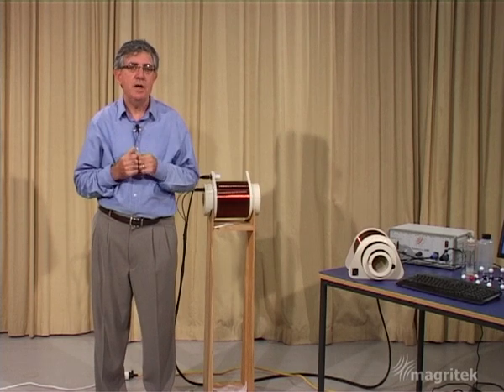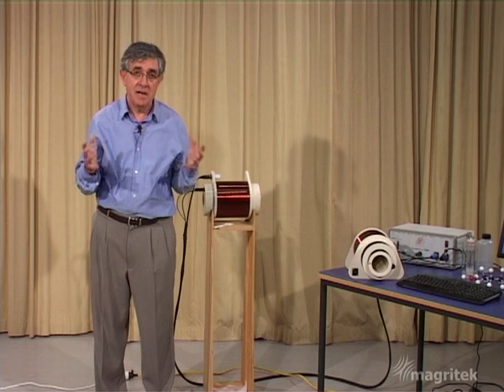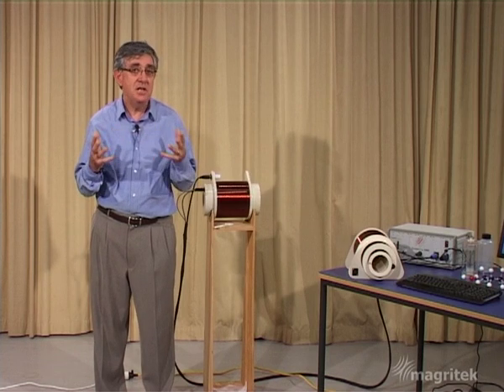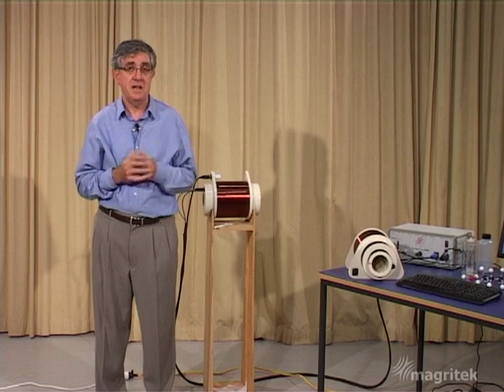Coming back to our static field: to get a homogeneous field is actually quite an expensive thing. In fact, that's what you pay a lot of money for when you buy a superconducting magnet for a hospital MRI system. But nature actually provides us with a homogeneous static magnetic field for free — and that's the Earth's magnetic field.